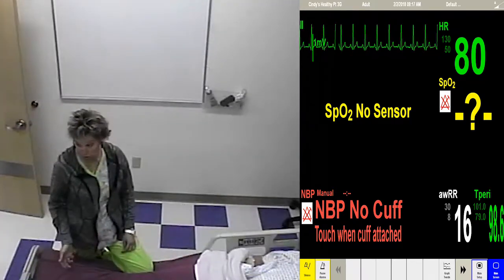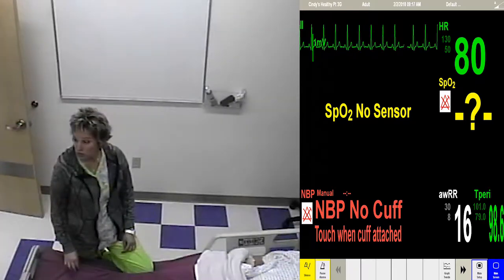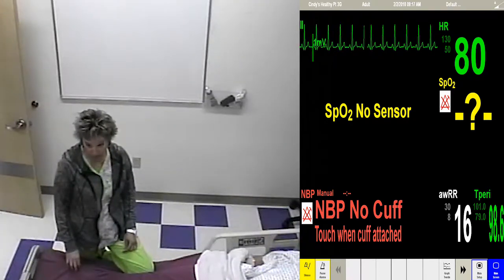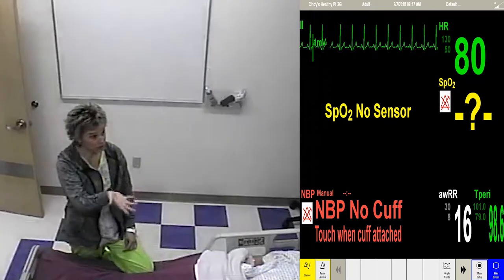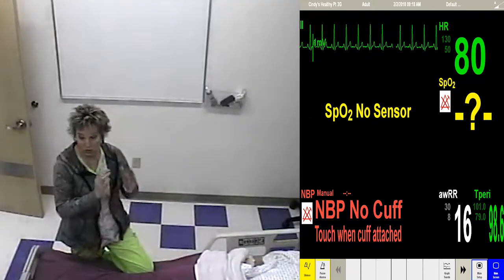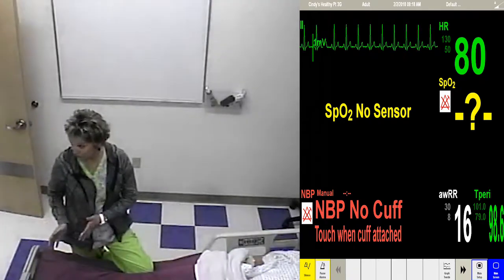A normal heart rate is? 60 to 100. Good guess, you were almost there. Okay, 60 to 100. This one is 80. So that is normal. So this rhythm is normal sinus rhythm.